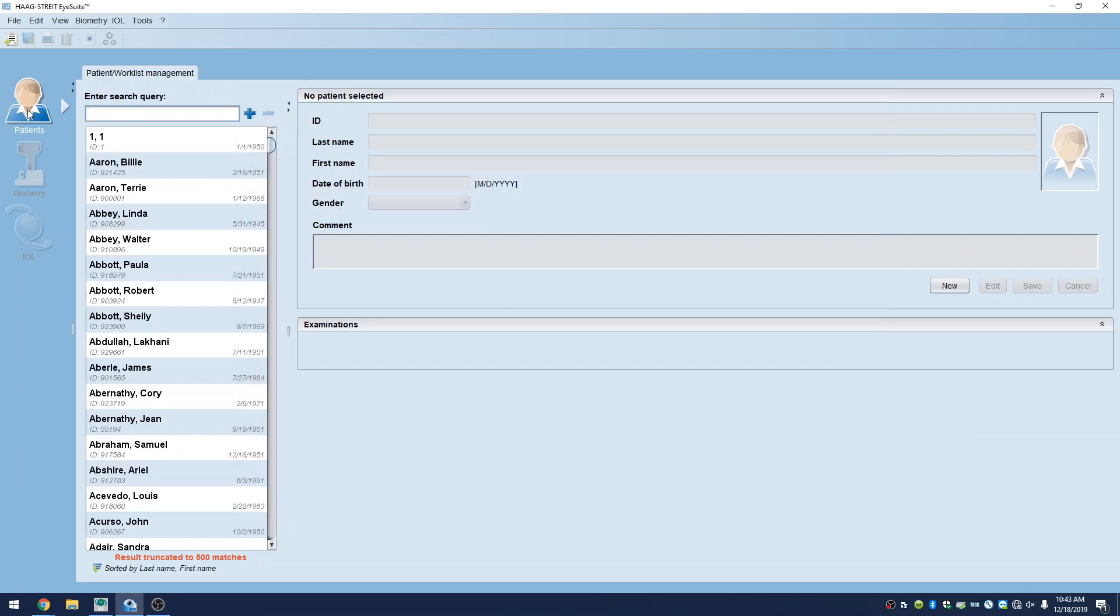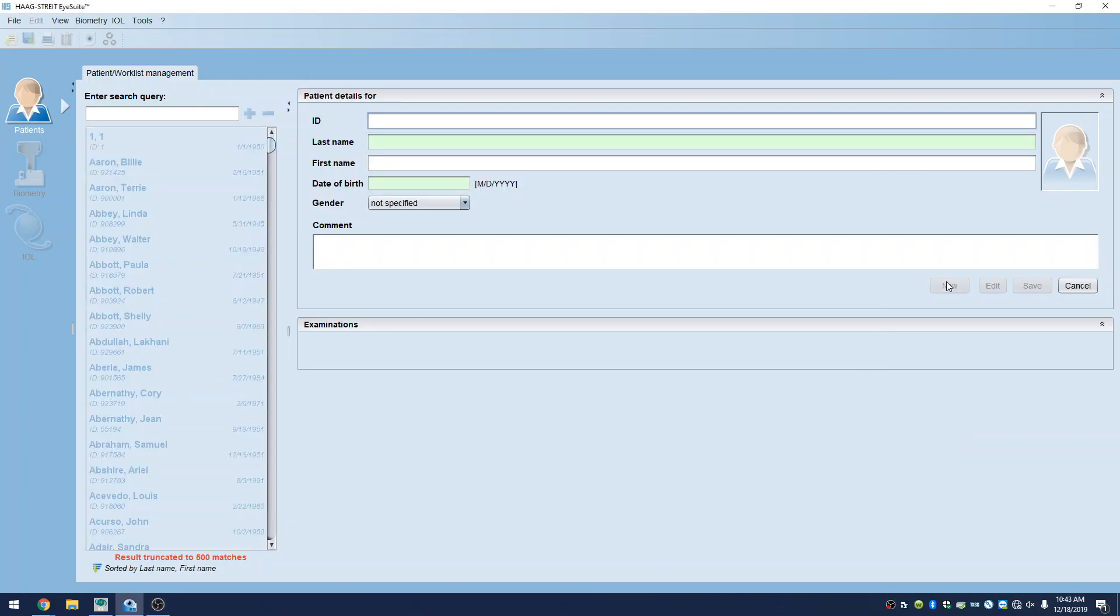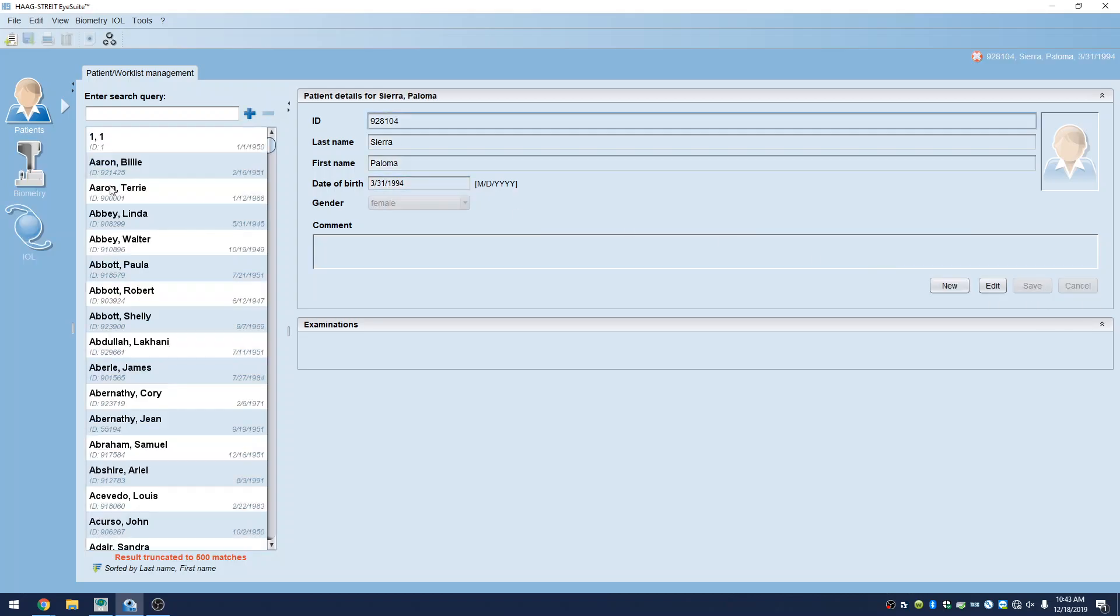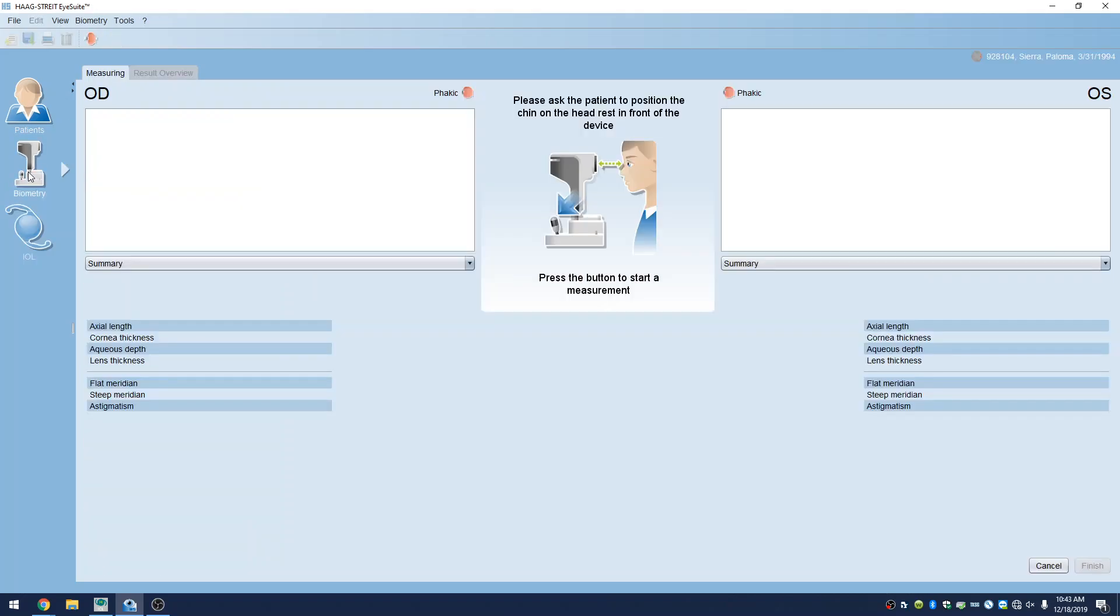Okay, so we're live. First, we're going to go ahead and enter in patient data. And then we'll hit biometry, and now we're in the data acquisition screen.